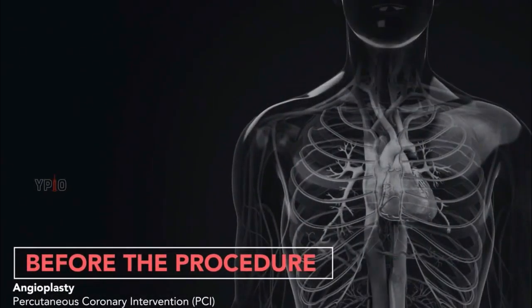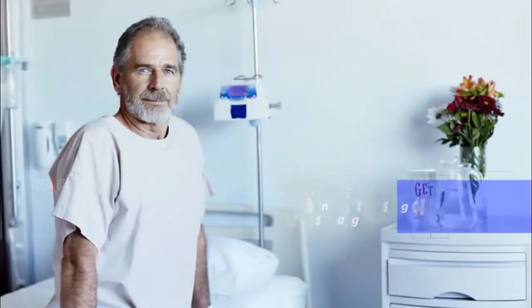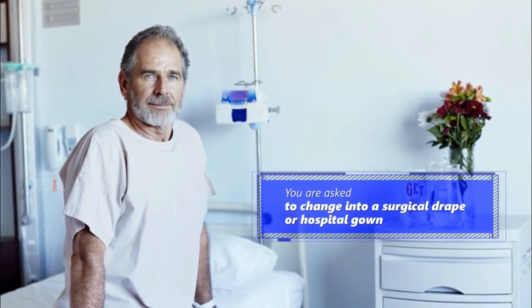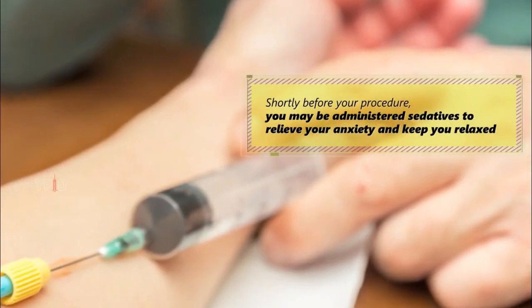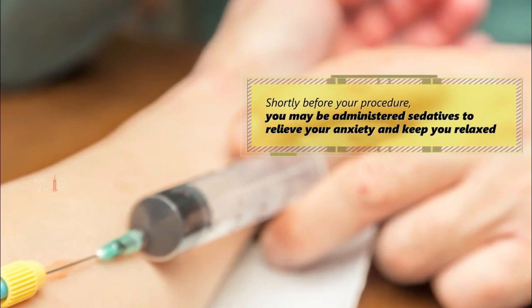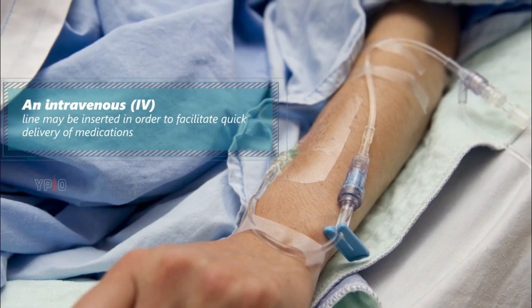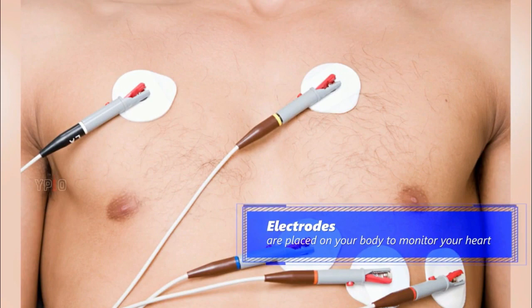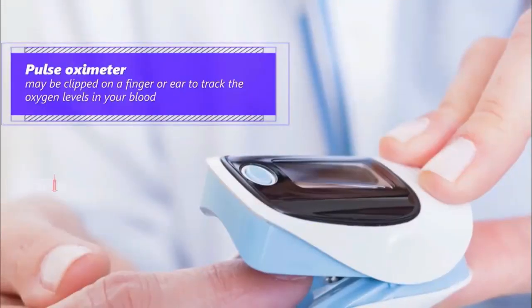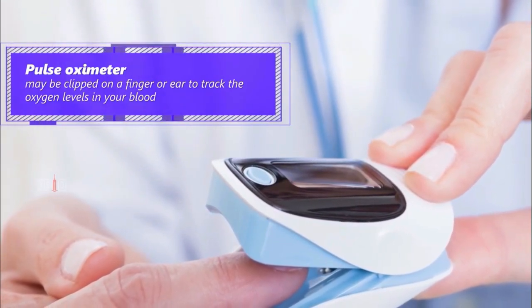Before the procedure. Depending on where the catheter will be inserted, you may be asked to shave the area a day before the procedure. You are asked to change into a surgical drape or hospital gown. Shortly before your procedure, you may be administered sedatives to relieve your anxiety and keep you relaxed. An intravenous IV line may be inserted in order to facilitate quick delivery of medications. Electrodes are placed on your body to monitor your heart. A small device called a pulse oximeter may be clipped on a finger or ear to track the oxygen levels in your blood.